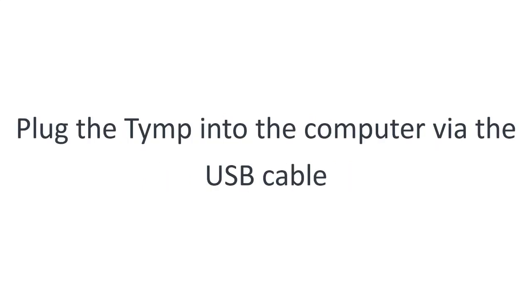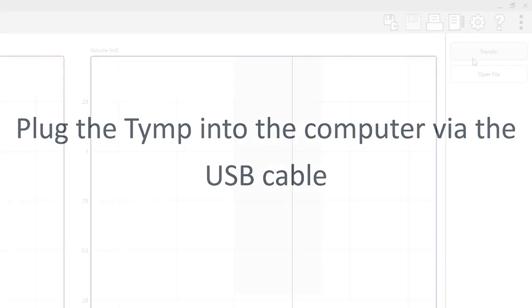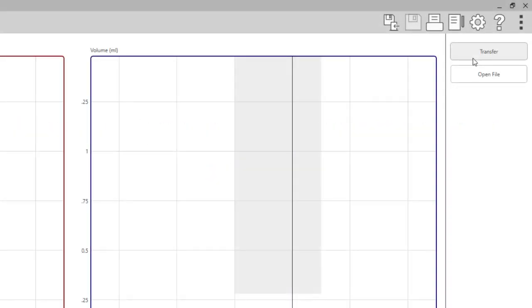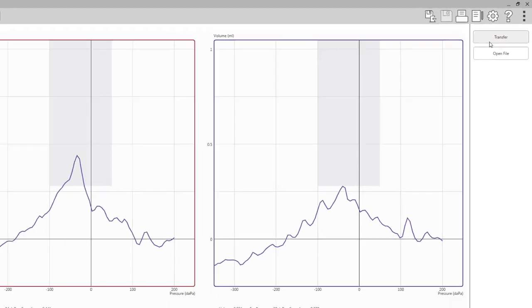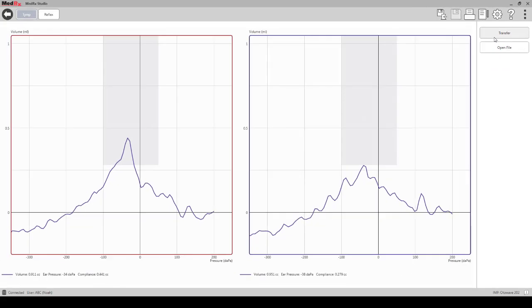Plug the tymp into the computer via the USB cable. Hit transfer. You will see the tymp tracing and reflexes in studio.